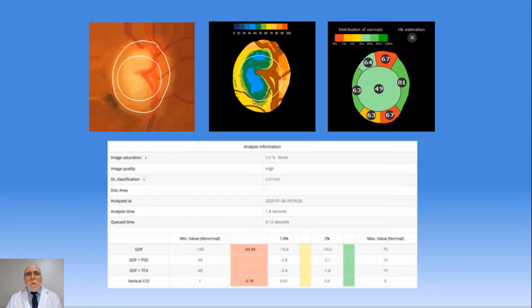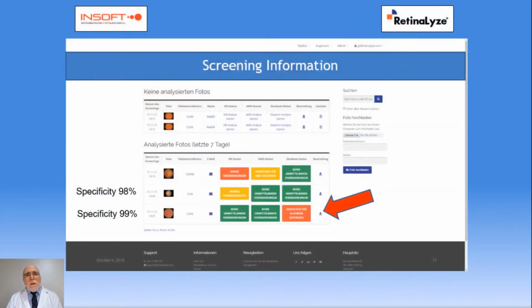Quantitative data are only available to ophthalmologists and must be interpreted along with other clinical parameters and other diagnostic methods. And when used as a population screening method, a risk probability orientation is obtained that guides the need to refer the subject to the ophthalmologist to perform the complementary studies and confirm or discard the diagnosis.